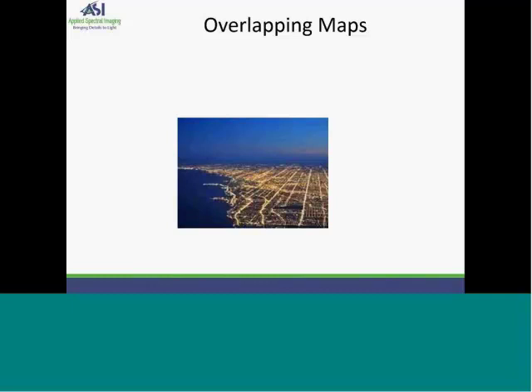I wanted to give an analogy of how tissue match works. And being that I come from Chicago, which has a beautiful skyline, I thought it would be both appropriate and very explanatory to use this image of Chicago taken at night. If I were asked where the tallest building is located, I would not be able to give an exact answer. At best, I can guess based on my knowledge of how the city is spread out, or after spending a lot of time examining the image, come up with a few general areas that look promising.